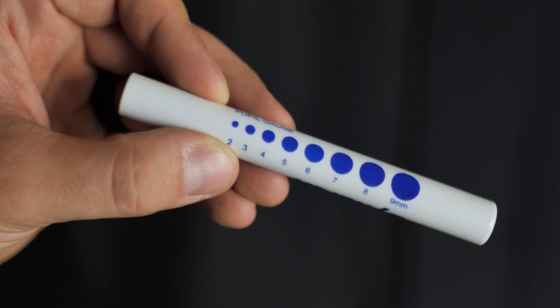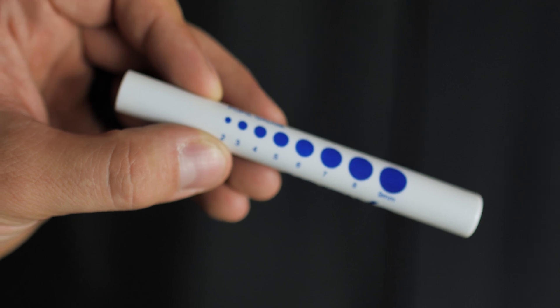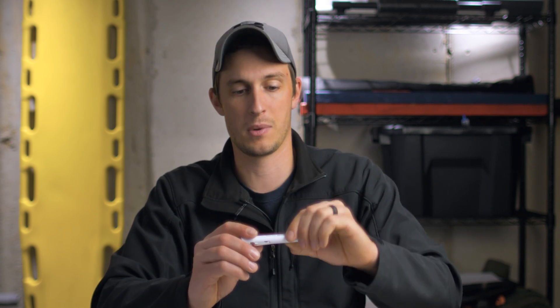Two different options of pin lights that we sell on our website are a real small disposable pin light. This is a great option to throw in your kit — super cheap. It has a built-in battery, so once the pin light dies you'll have to throw it away and get another one. But they're economical enough to throw a couple in different medical bags, and it's not going to break the bank.